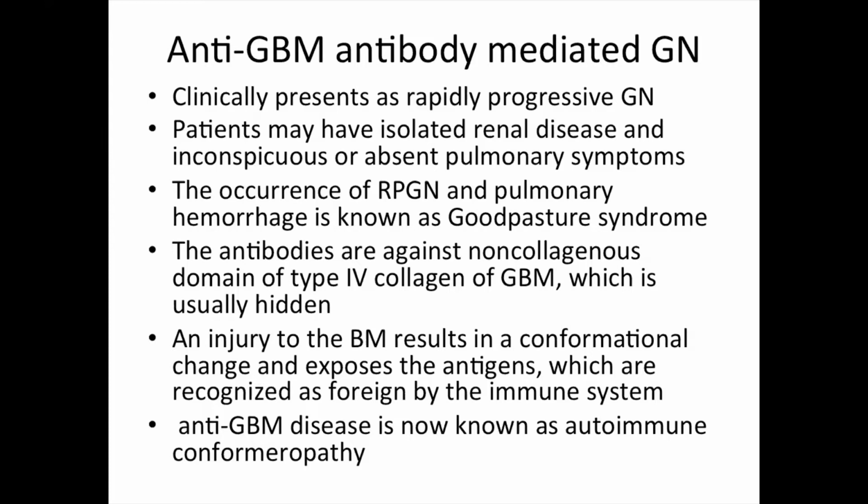If most of this patient's crescents are fibrous, the kidney is gone, bye bye. But if most of the crescents are cellular, it means this is possibly a reversible disease and they will be more aggressive in treating these patients.